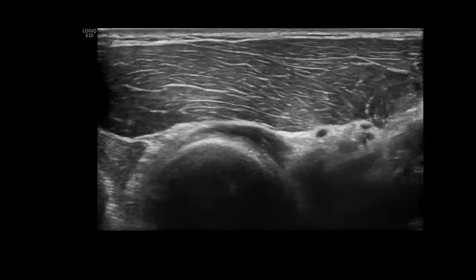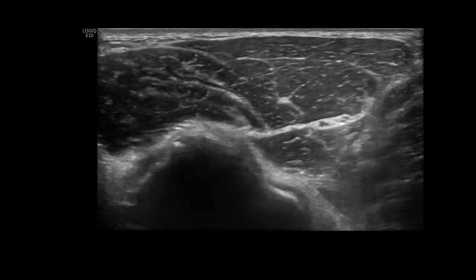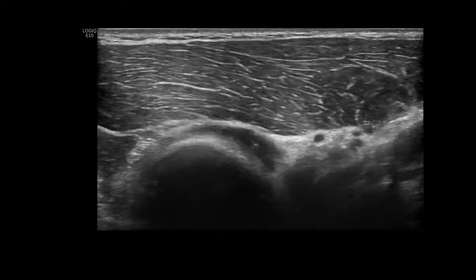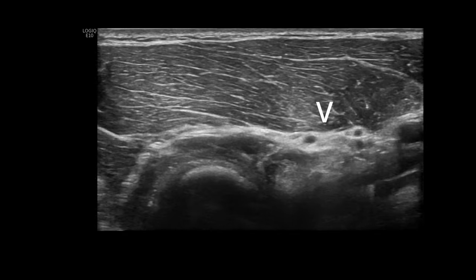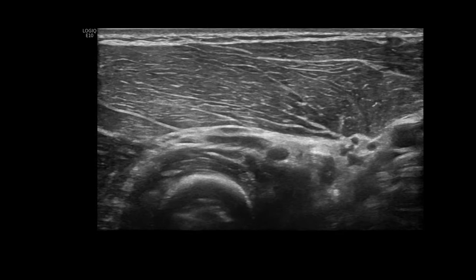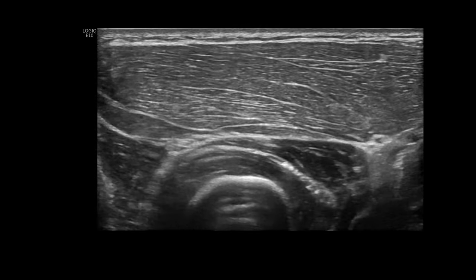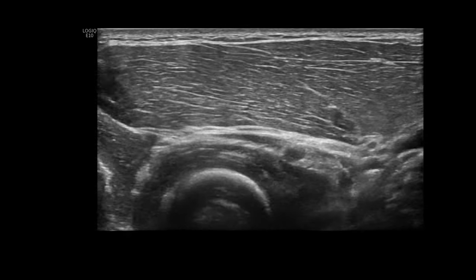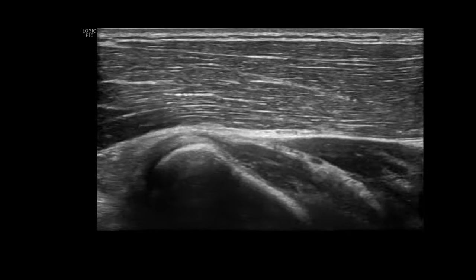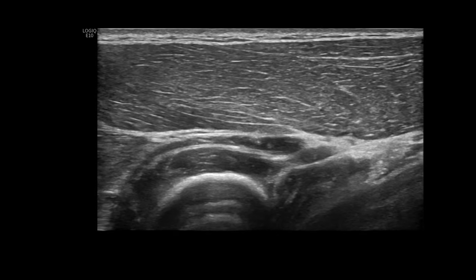To evaluate the radial nerve, begin by locating the main trunk of the radial nerve in its short axis, positioned between the brachioradialis and the brachialis muscle. Trace the nerve down to where it bifurcates into the superficial sensory branch and the posterior interosseous nerve. Continue tracking these nerves in their short axis using meticulous scanning techniques. It is crucial to demonstrate the posterior interosseous nerve in short axis planes as it penetrates the supinator muscle, passing through the arcade of Frohse, located between the superficial and deep parts of the muscle.